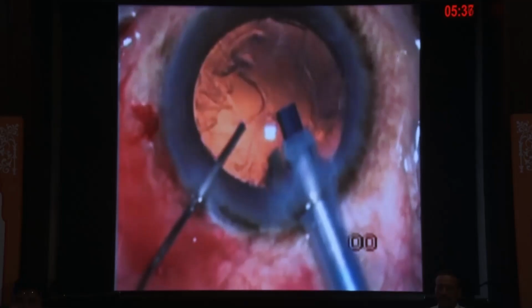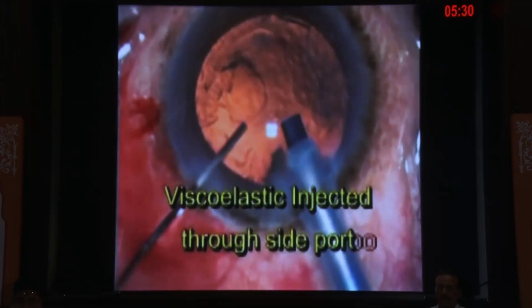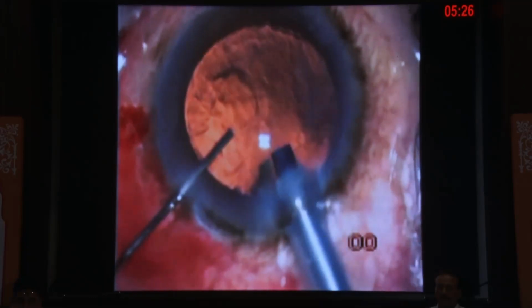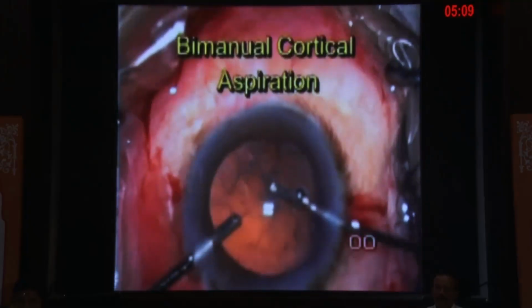So the second step they always tell is make sure you fill the anterior chamber with viscoelastic. Yes, if you use a high density viscoelastic, it plugs that hole. The same way, you don't let the anterior chamber collapse when you bring out. So the concept is, sometimes the anterior hyaloid doesn't rupture. It is only when you come out and it flattens that the anterior hyaloid ruptures and you see the vitreous prolapse. So there is a rupture, but it doesn't mean that all cases will have a vitreous prolapse. So as long as you can maintain the anterior chamber and come out, you still have some safety margin and less amount of vitreous.